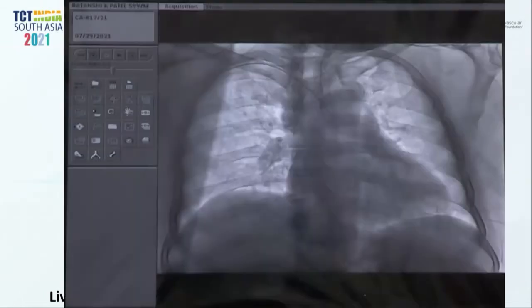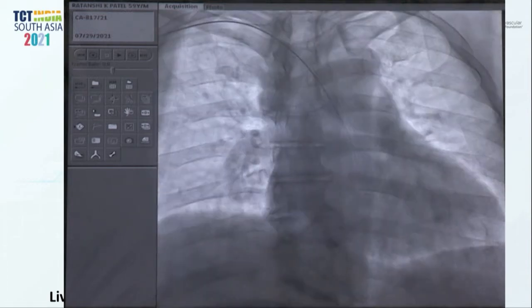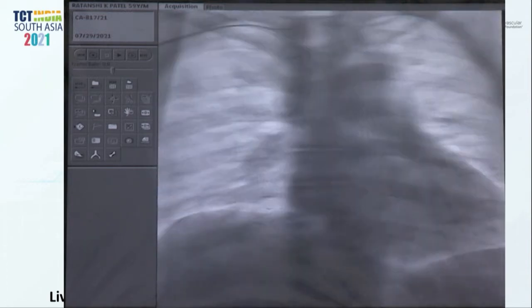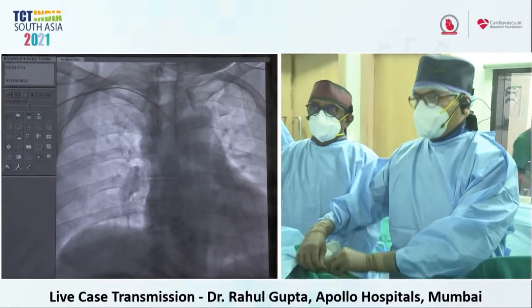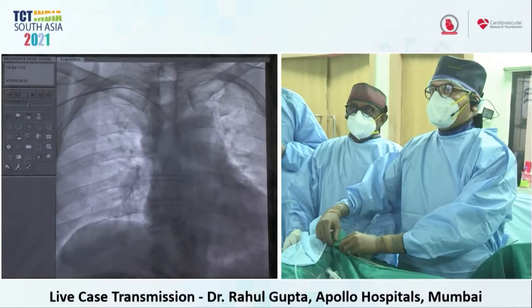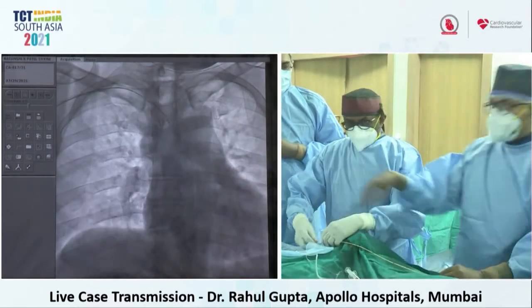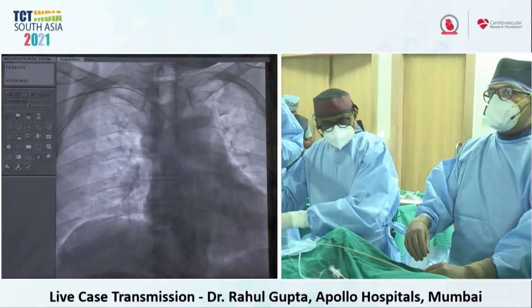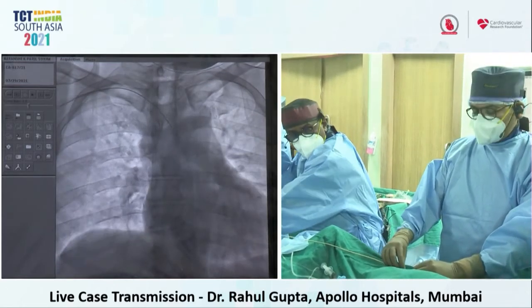Yeah. So till the subclavian, I am going with the dilator as well, because the dilator is also helping me to track the guiding. You don't need it, but it can help you in tracking. And then you can remove just the dilator. So now I'm removing the dilator because my guiding has reached the subclavian. So Dr. Pillai will remove it, and then I can just move ahead.